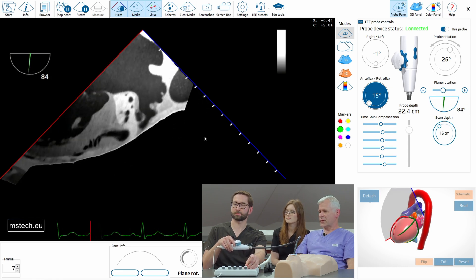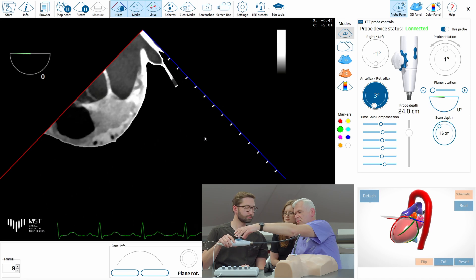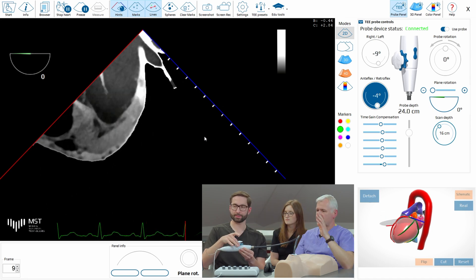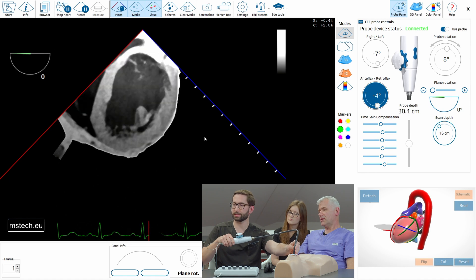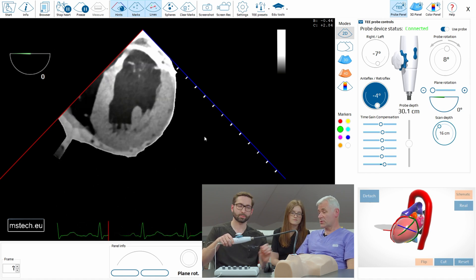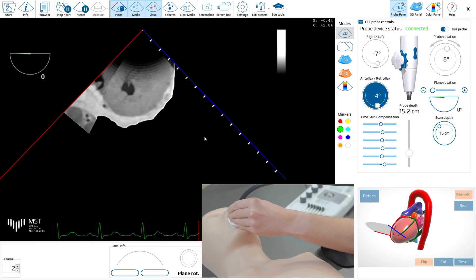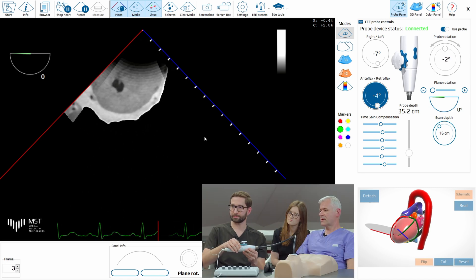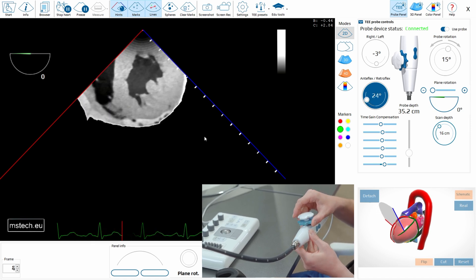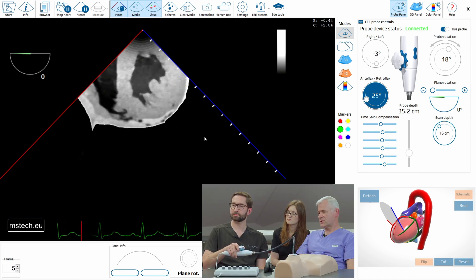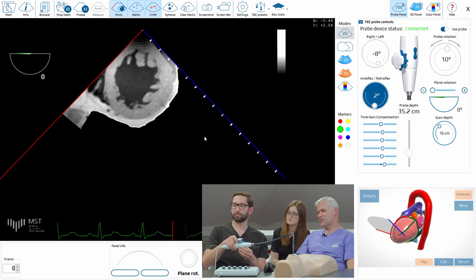Now let's go to transgastric. Release and insert. Always remember when you insert the probe, check if it's not fixed — check the knobs. So how deep is usually transgastric? Approximately 35, 40, 45 centimeters depending on the height of the patient. So here we are at 35. Now antiflex — the image will improve and you will see the better circular shape of the left ventricle. Which level are you on? Papillary muscles.